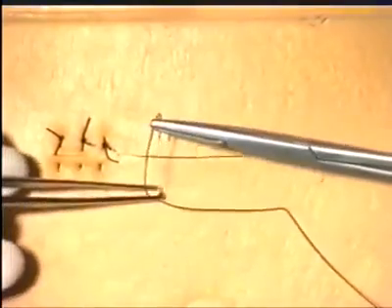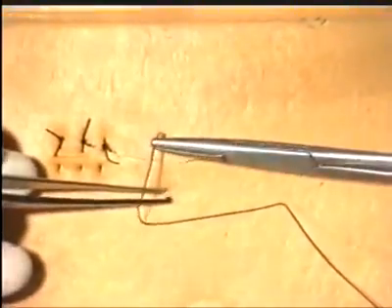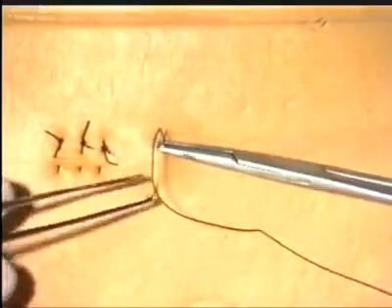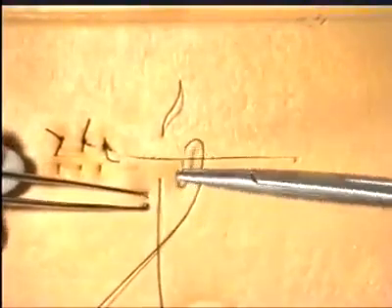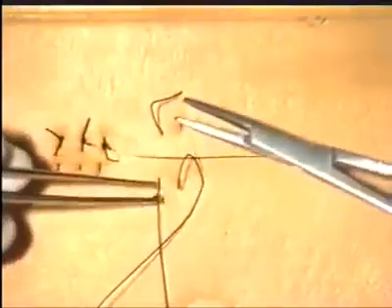We will now demonstrate the horizontal mattress suture. The initial suture is as before. Again, reverse the needle in the needle holder, but on this occasion move slightly horizontally and go back to the other side of the incision in a similar manner.